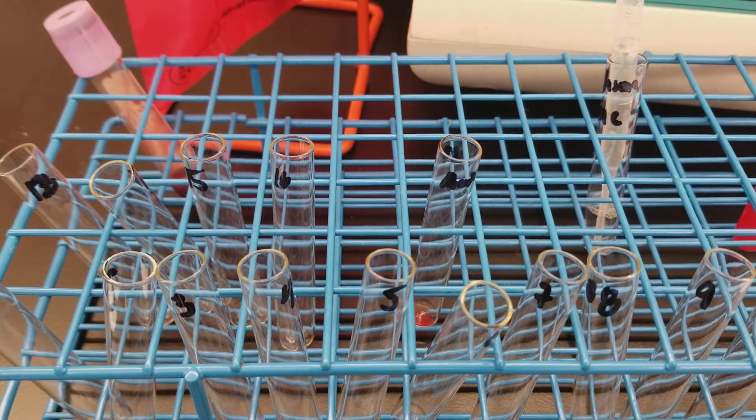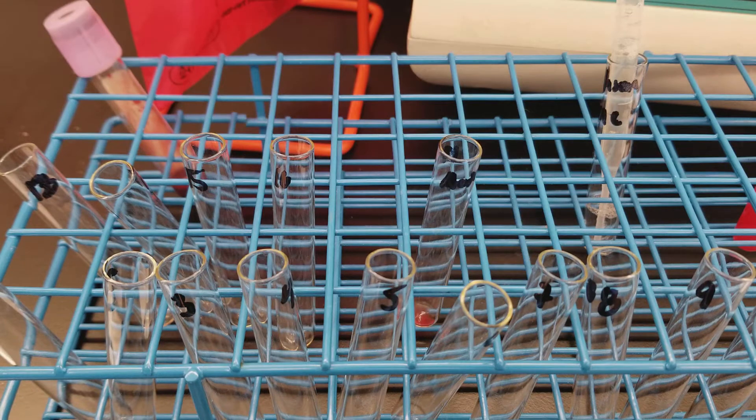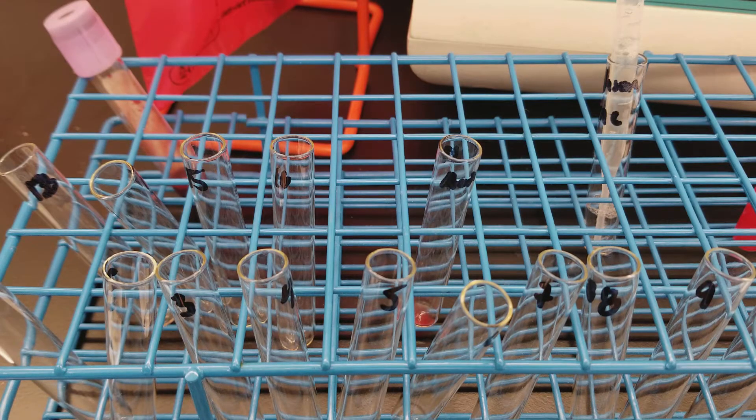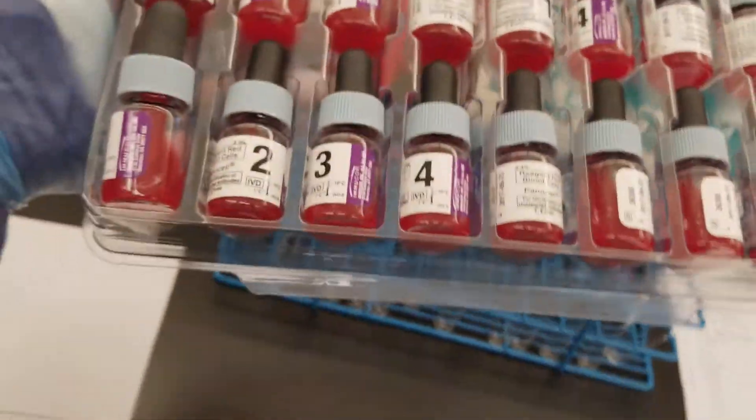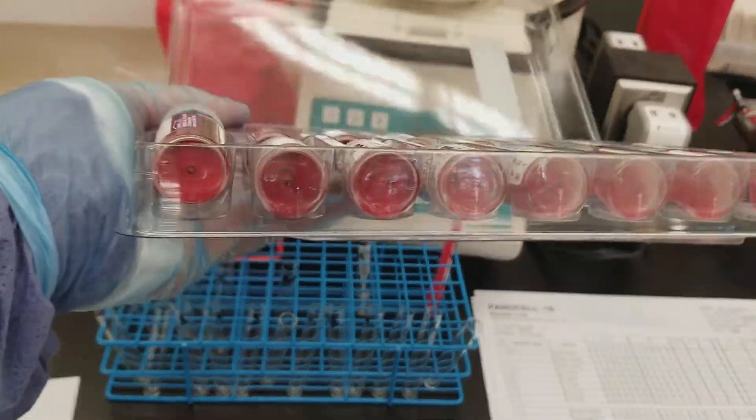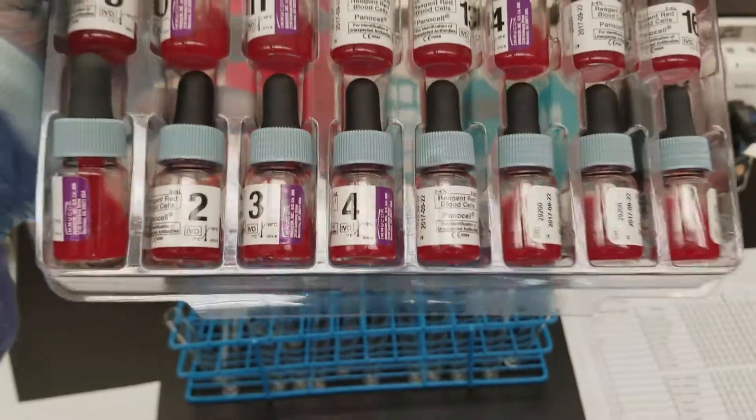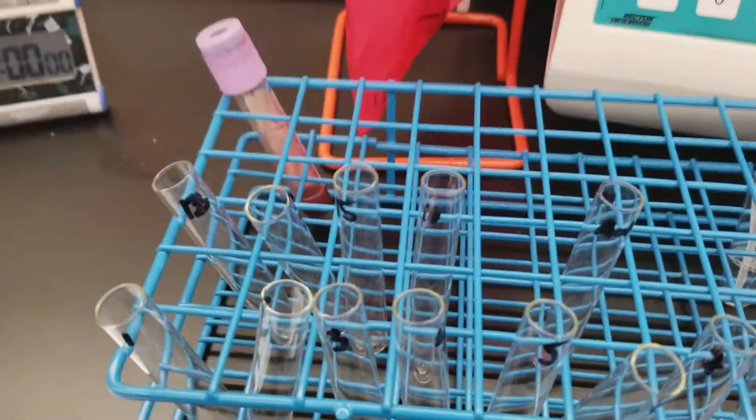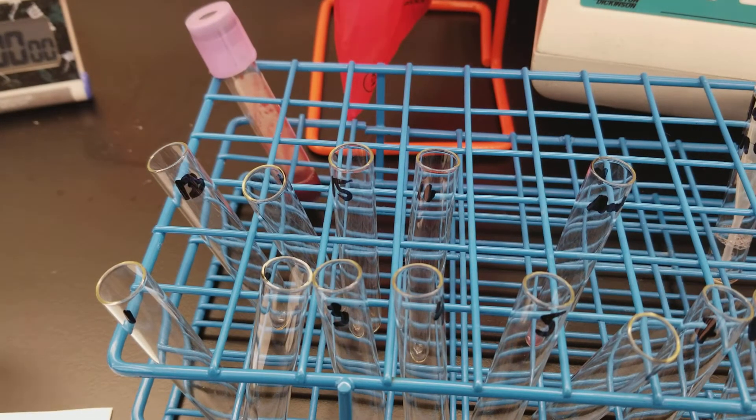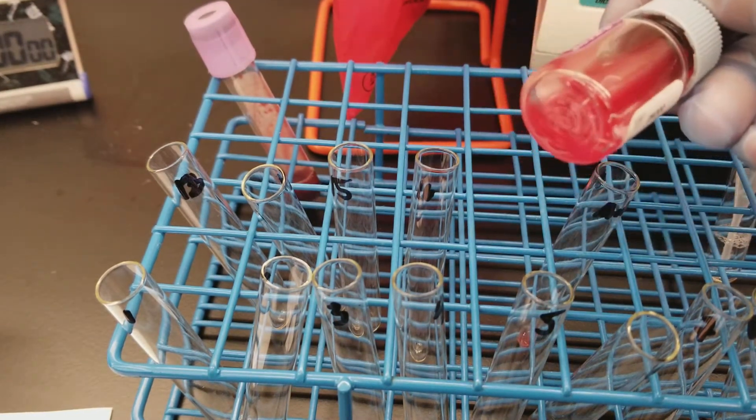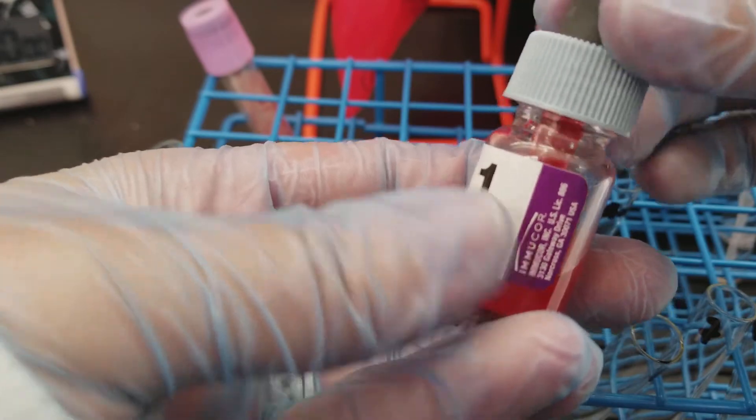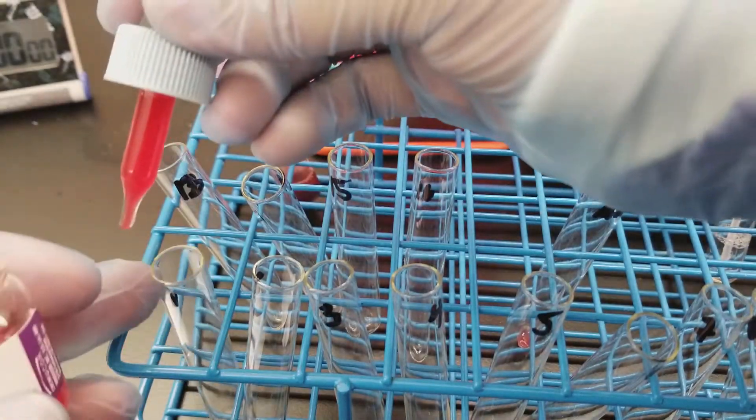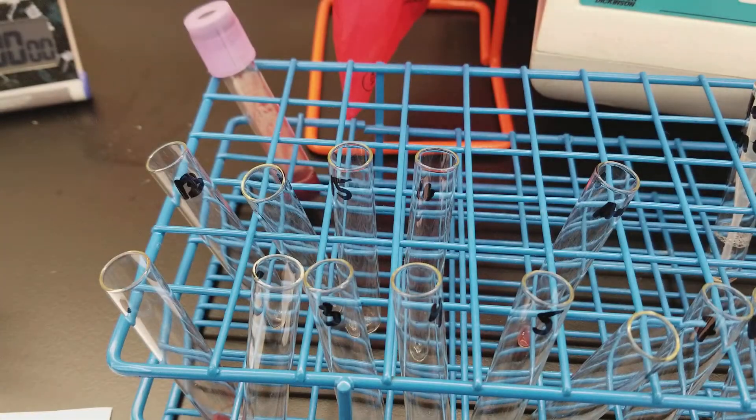Now we're going to put the reagent cells in. This panel is huge. This is going to be great. I like to rock them when they're still in the container here, so you can rock them this way gently. That way you do them all at once and they're all ready for you. You'll know when they're all ready for you when there aren't any cells that are stuck to the bottom of the glass bottle. When you do this, you also still bring them up, resuspend them a little bit just in case they were sitting since we have so many cells. I still can't get over that.